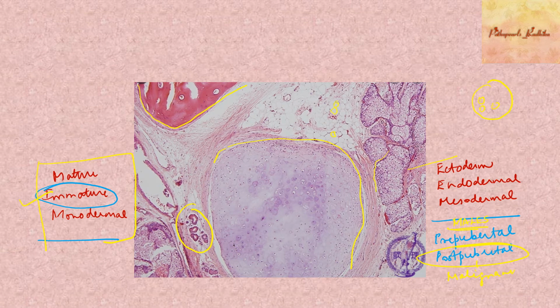You can have skin as well, which is not in this field. You can have a skin epidermis as well, right? So you have derivatives from different layers. So it's a mature teratoma.